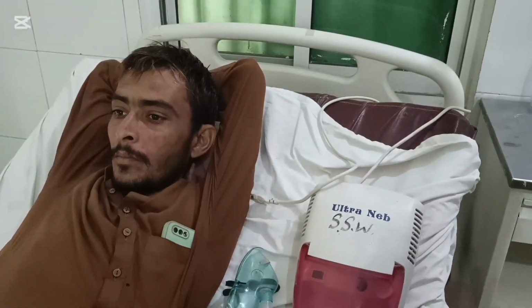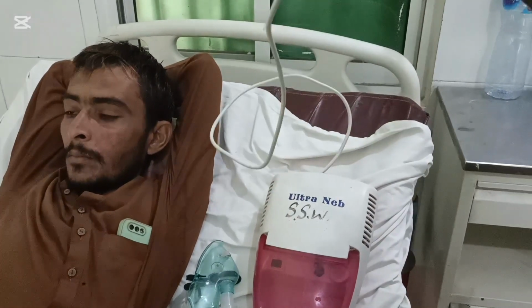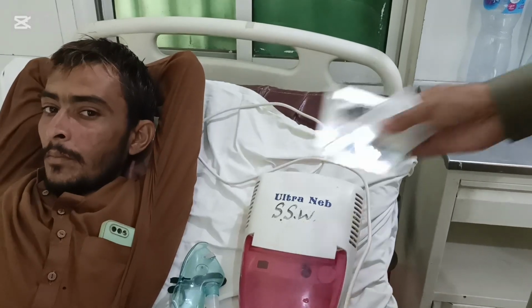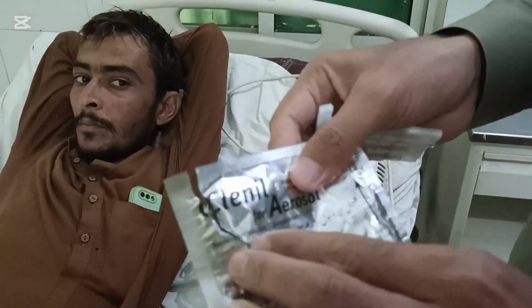Now, how to nebulize the patient? To nebulize the patient, you should have the nebulizing machine. This is the nebulizing machine you can see over here, and you should have the required drug. You can see over here, this is the drug which is used in nebulization.